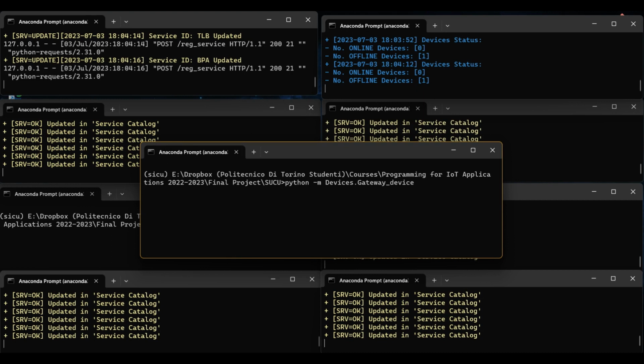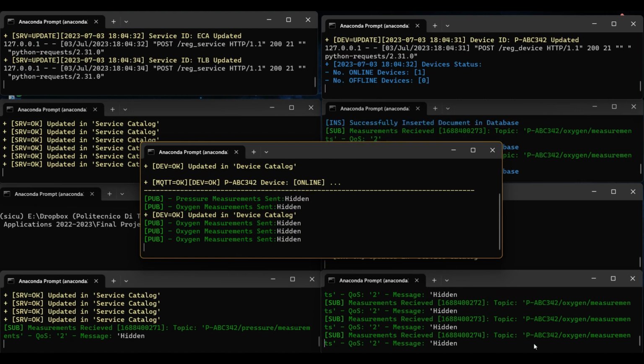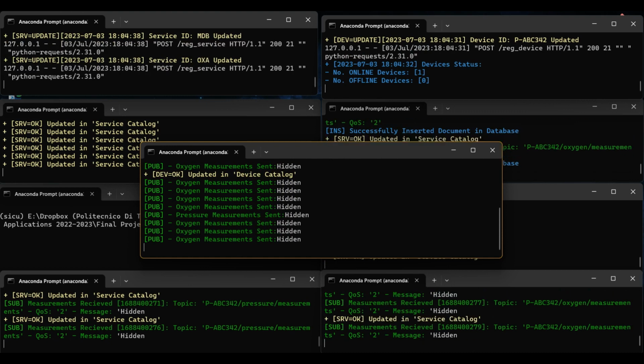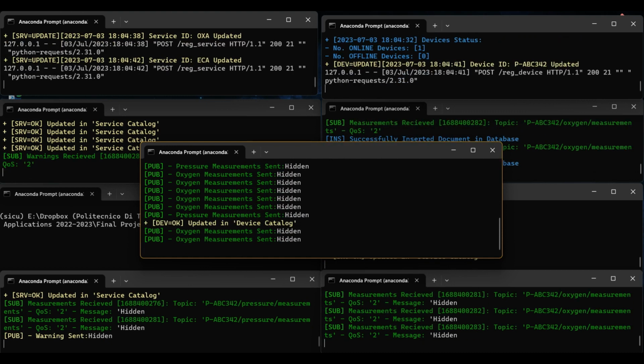So now let's check the functionality of the microservices. We're going to execute the gateway device that we are going to use as a bridge between the sensors and the microservices in our platform. So I'm going to run and execute the gateway device file, which is actually hosted on the Raspberry Pi, and see what happens to different microservices.